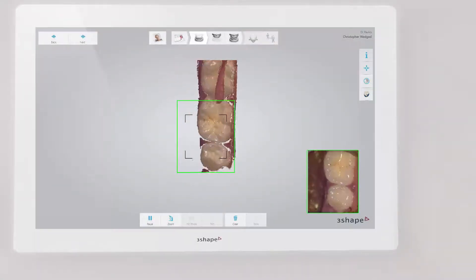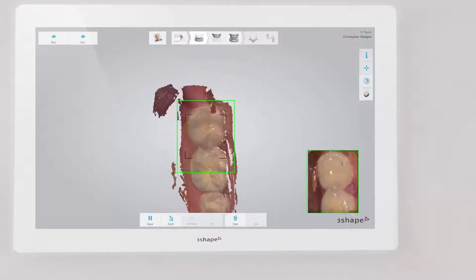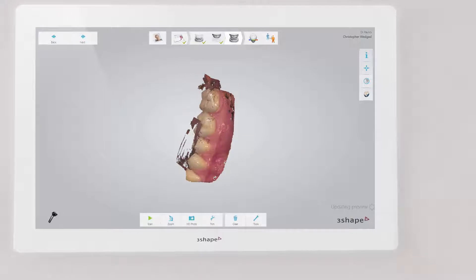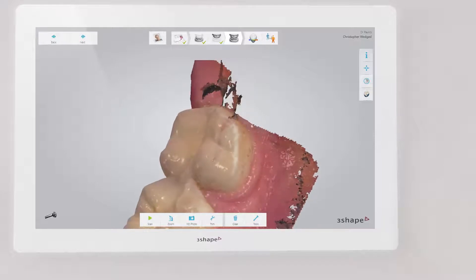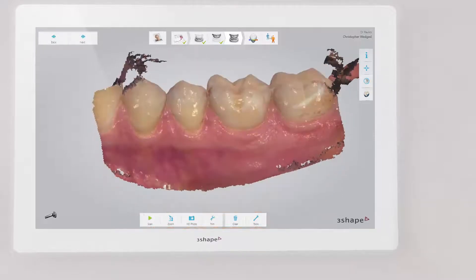Artefacts may result from soft tissue — lips, cheek, or tongue — being scanned onto the teeth. You can fix that by retracting the soft tissue from the teeth while scanning, using, for example, a dental mirror. Areas like these may interfere with a good bite scan and therefore compromise the occlusion.